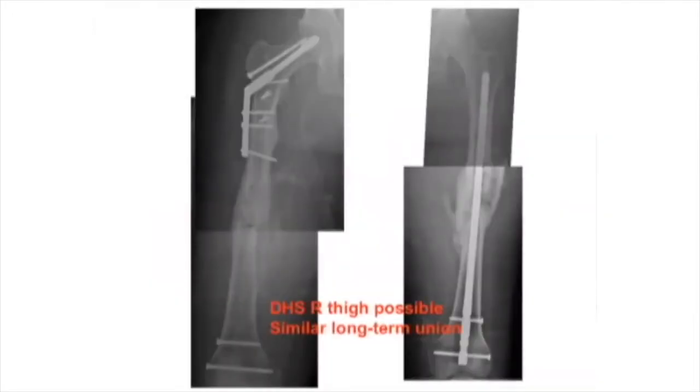So what I did, I cheated a little bit. The size nail on the femur on that right was a 9 or 10. And so I had enough space around it, and I floated the screws in front and behind the nail. So I made a transcortical screw. Whereas the nail on the left, I think that was a 1 millimeter larger.